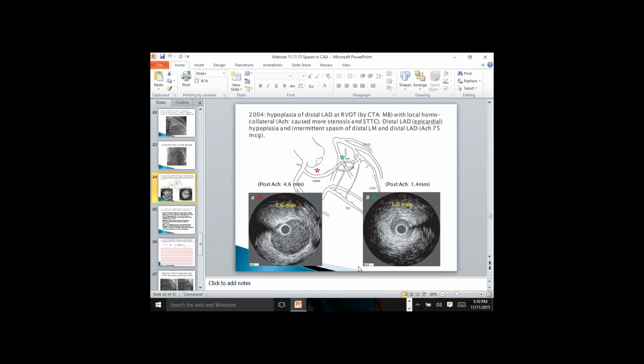So we decided what we're going to do about that, and we said, well, we ought to be able to see it with coronary CT, and let's do a CT with one rotation of the gantry just to look at the origin of the arteries and not do anything else. And we got that down to 0.7 millisieverts. So we're able to look at the coronary origins with a CT scan without much radiation exposure now with one gantry rotation.